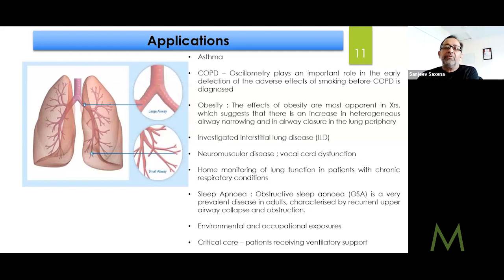It makes sense. We would talk about blowing into that, and it was really hard for kids to blow into it. Whenever you talk to kids or geriatric patients, you tell them to blow. My father had Alzheimer's, and you tell him to blow, he wouldn't be able to, right? So for someone who's got Alzheimer's or dementia, I think this would be phenomenal because now you're just measuring sound waves, right? So that's a little feedback.